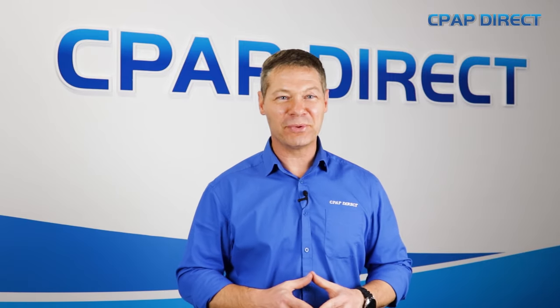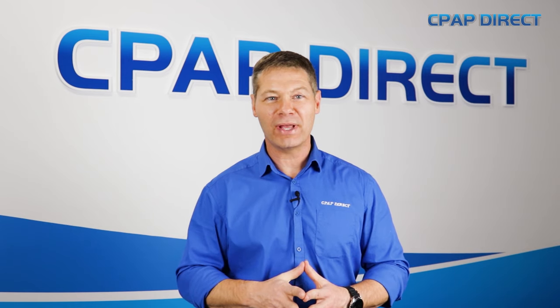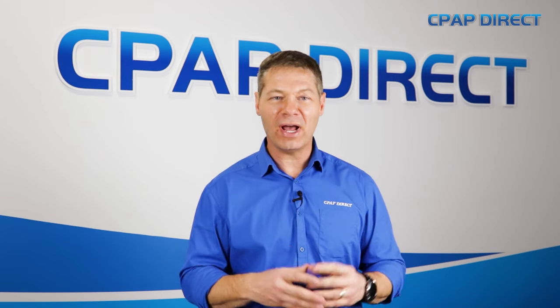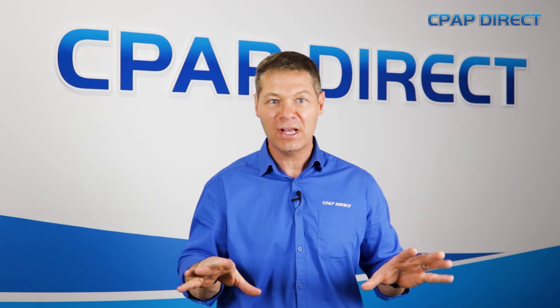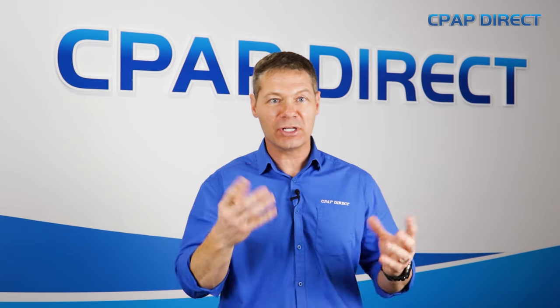Hi, I'm Bryce from CPAP Direct. In this video I'm going to cover the four different types of masks that we have in the CPAP world. The first three that I'm going to show you are nasal delivery style masks, which means that you must be able to breathe through your nose in order to use any of these masks. The last one is for people that are mouth breathers and can't really use their nose.